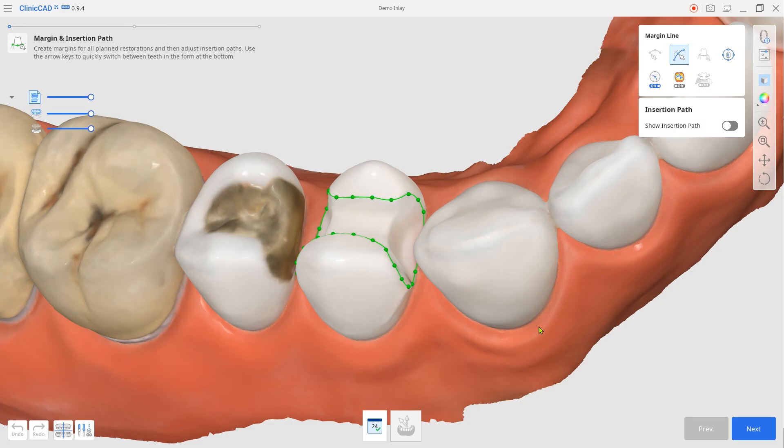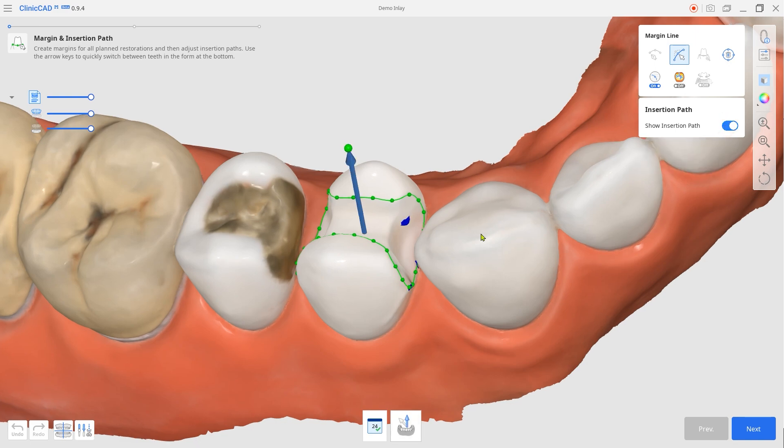Next, you can view the undercut of the prepped tooth once the insertion path is set.